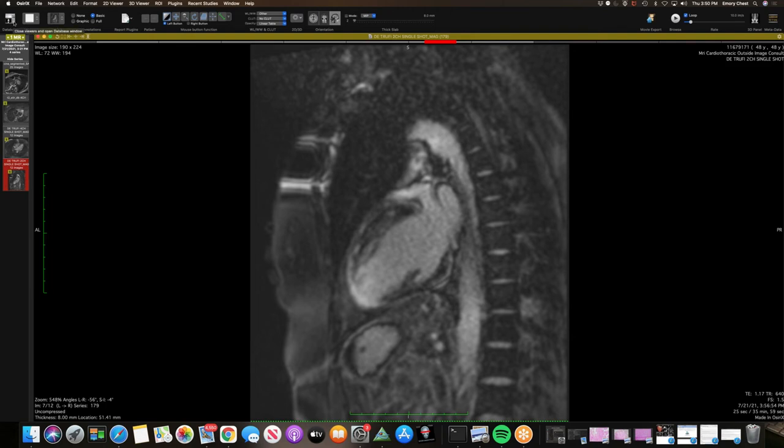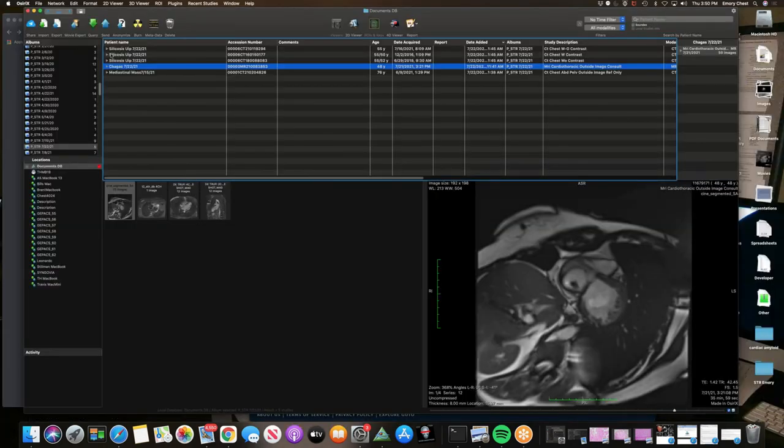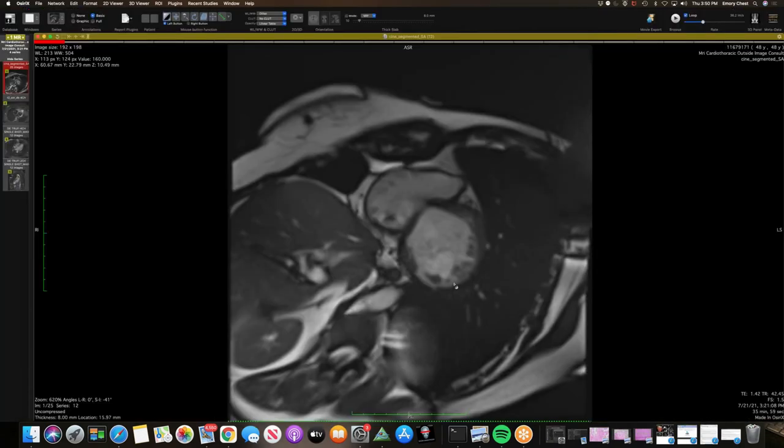Was there any esophageal involvement? Good question. I don't know. I don't think there were. No esophageal involvement. It looks like there's some secondary non-compaction there at the lateral base. Yeah, I thought it was basically just an aneurysm, but yeah, you can see it. I guess it would be hard, because if the whole myocardium is thinned, to do those measurements of the non-compacted and compacted myocardium.